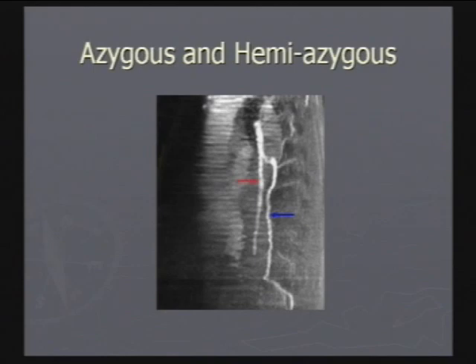out of the textbook. It's not very good here because when we collect this data, the person's breathing, and so these little black stripes you see is because the person is in a different position each time we have collected that 2D slice. The individual slice itself looks very good, but when I try to present it to you in this cross-sectional view, you can see the artifacts associated with it. Nevertheless, I hope we can continue to improve the ability to do the azygos.